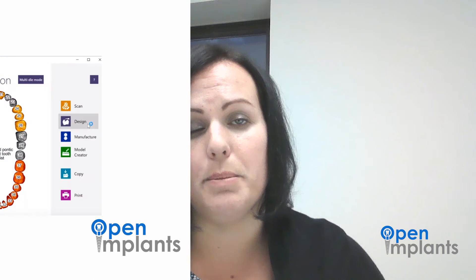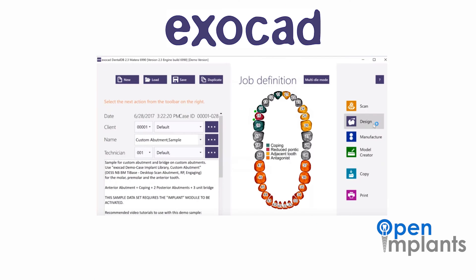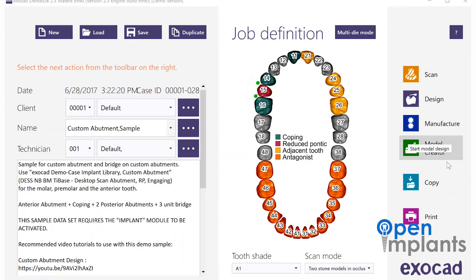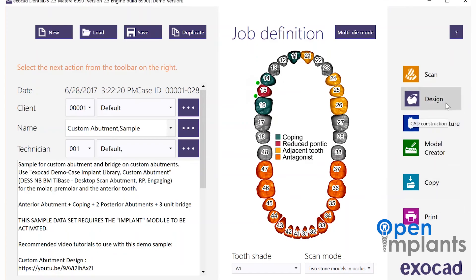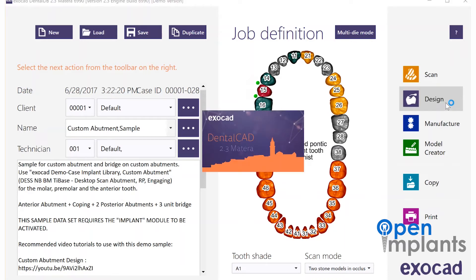Hey guys, I'm Carrie Coakley, the Education and Support Manager here at Open Implants. Today I'm going to go through the implant libraries that we have available in Exocad. In Exocad, the implant selection is located in the design step, not in the scanning phase, so we're going to go straight to that window first.